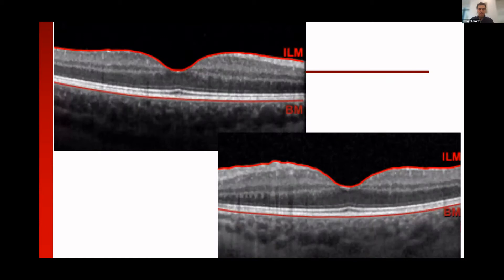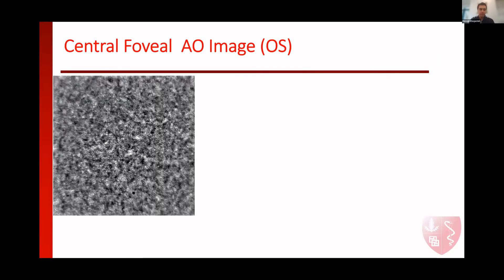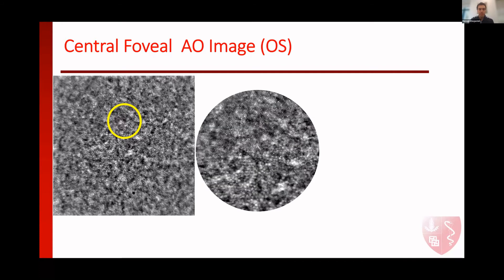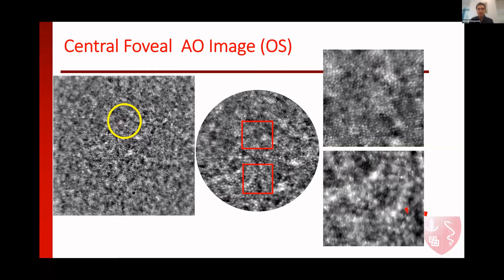Let's have a look at the OCT of both eyes — you can see there is no abnormality and it seems unremarkable. Now, looking at the AO image of the left eye, this is the central foveal AO image. Look at the central part — the cones are visible. I pick up the area at the margin between normal and puffy cones. Here you can see the normal cone mosaic, and here you can see the enlarged, visible cones.